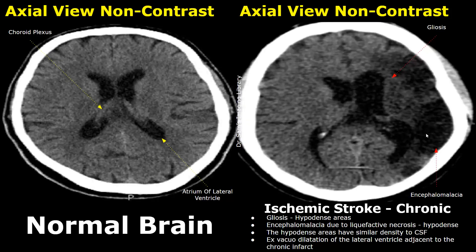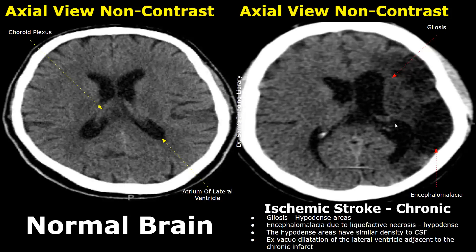These are the areas of encephalomalacia. The density of these areas will be similar to the density of cerebrospinal fluid that is seen within the lateral ventricles. Another feature is ex-vacuo dilatation of the lateral ventricle adjacent to the chronic infarct. We can see the lateral ventricle is dilated as compared to the lateral ventricle on the other side. This is a compensatory mechanism done to preserve brain function and is often seen in cases of chronic ischemic stroke.